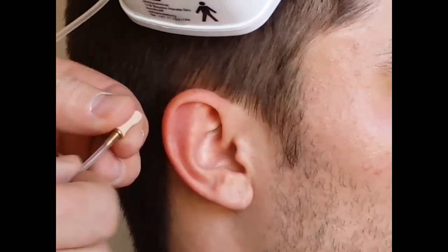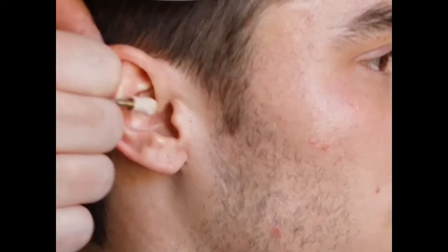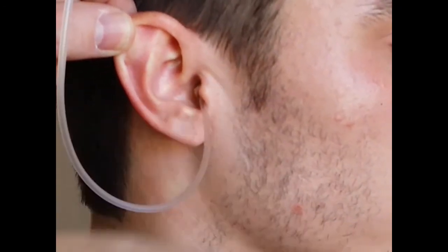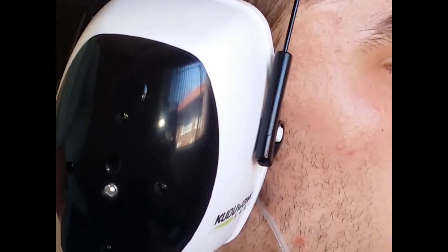I will then insert the ear tip into the ear like that until it stops. Show you until it stops. I will pull the ear and I will push the tube forward and wiggle the ear tip into the ear. Then I will put the cup over the ear again and do the same on the other side.